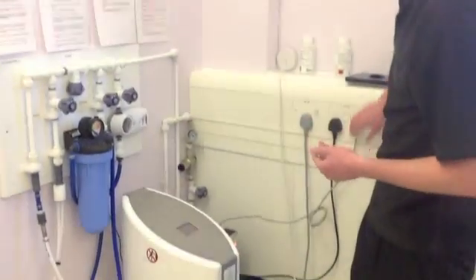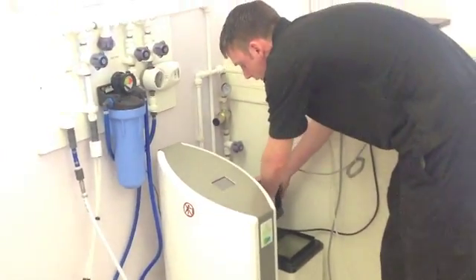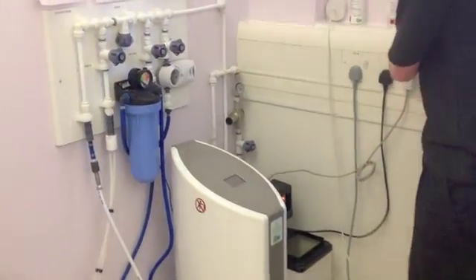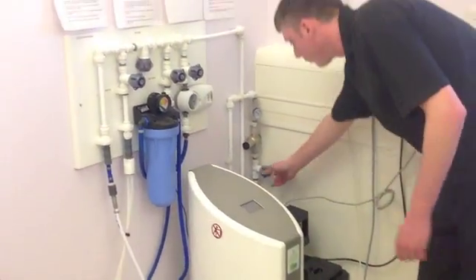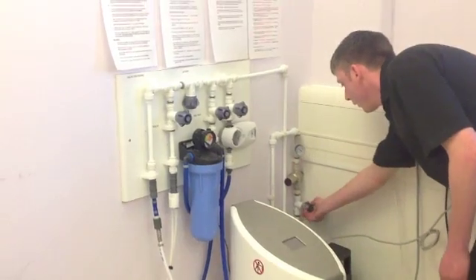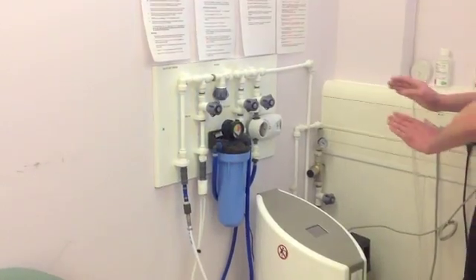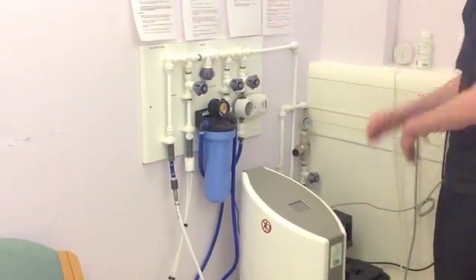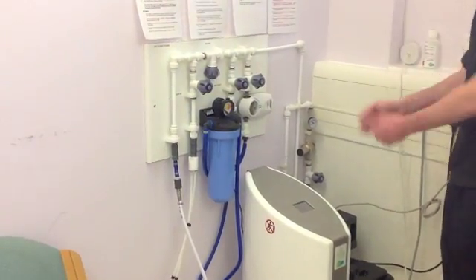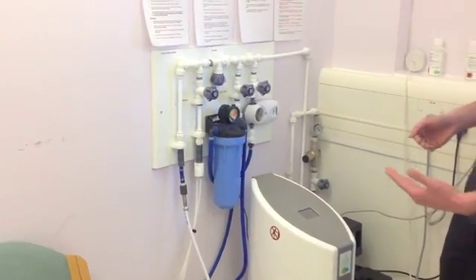As soon as this has finished regenerating, all you need to do is stick your covers back on and turn off your power. You can then turn off your water in and that is done. We would also like you not to do either of these on a dialysis day. If you are to do it on a dialysis day, please make sure it is afterwards rather than before dialysis, in case you do come up with any problems.